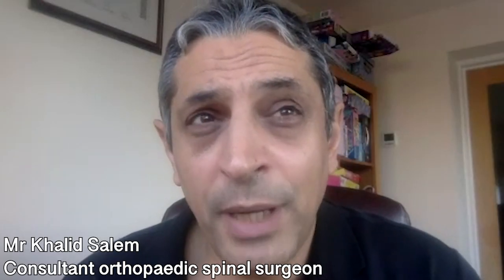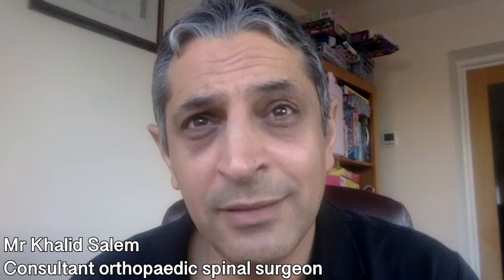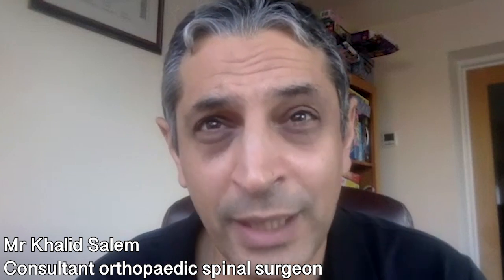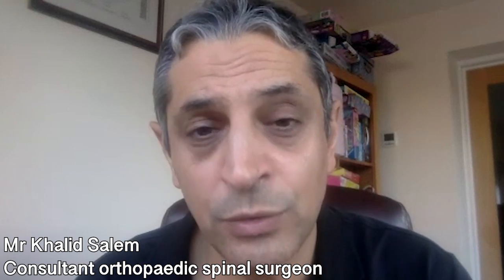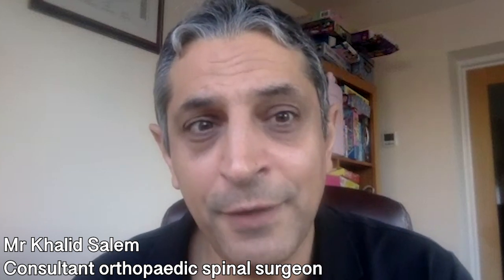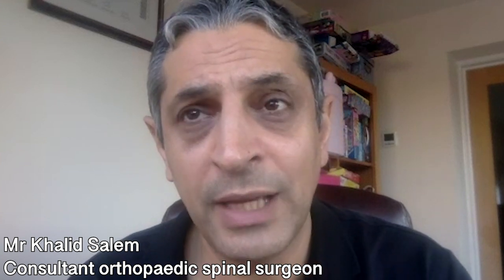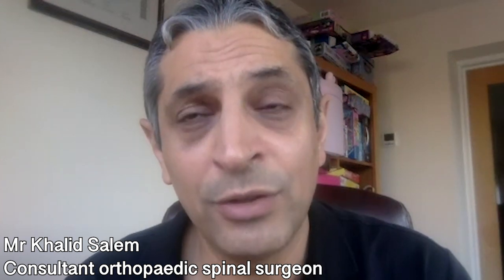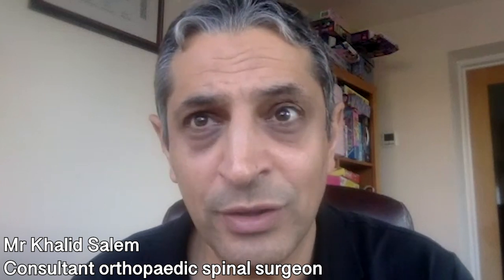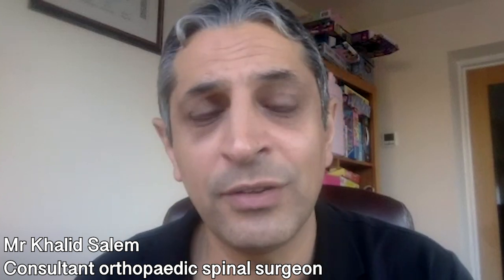Sometimes we can combine the two techniques, the minimal access to the spine and the accurate guidance of intraoperative navigation, to allow for an even more focused approach to dealing with the spinal pathology or problem. This further enhances the recovery and improves the outcome more, while reducing further the complications associated with more complex spinal interventions, such as putting screws or putting fusion cages in the spine.